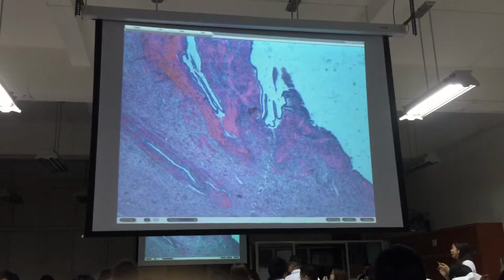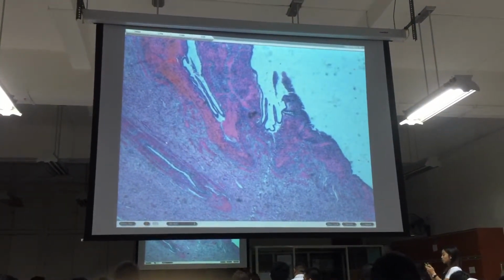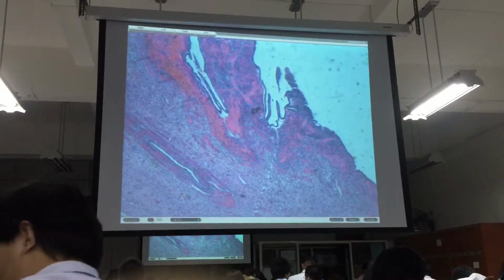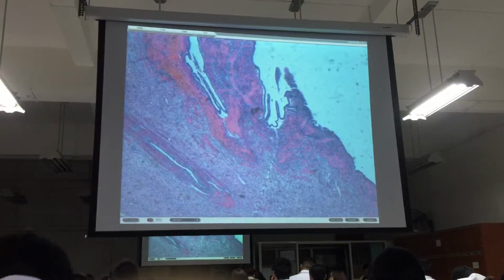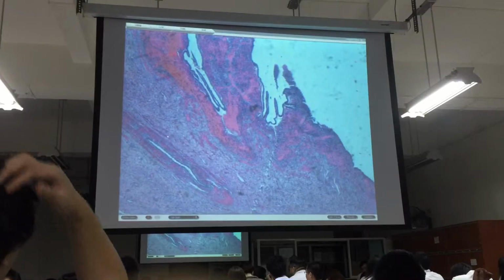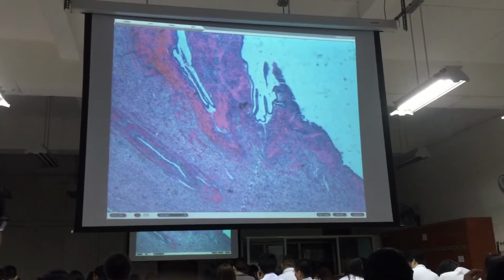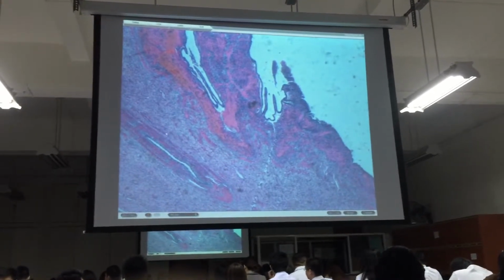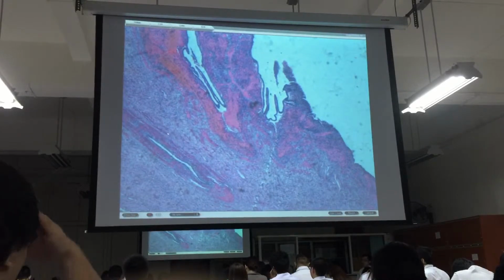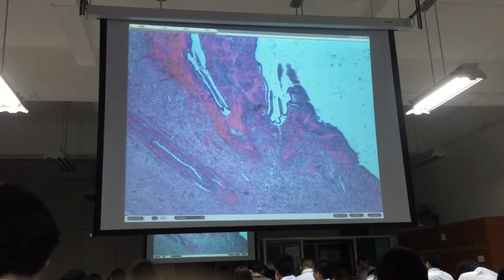One is that it could be lined by your endometrial epithelium or glands. It can be lined by endometrial stroma, or sometimes it is lined by hemosiderophages, hemosiderin-laden macrophages. To diagnose endometrial cyst, two of the components, two linings, should be present.